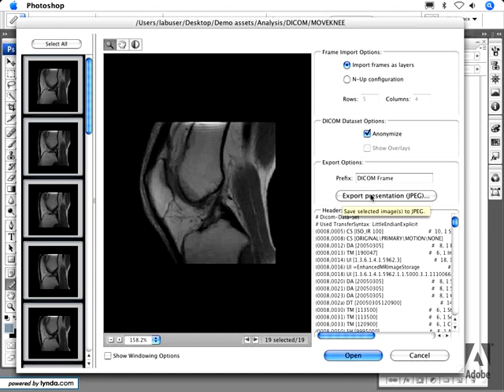You can also export JPEGs directly from this dialog box. If you want individual JPEGs of each of your DICOM frames, you don't need to go any further than this dialog — simply press the button and it will save individual JPEGs to your desktop.